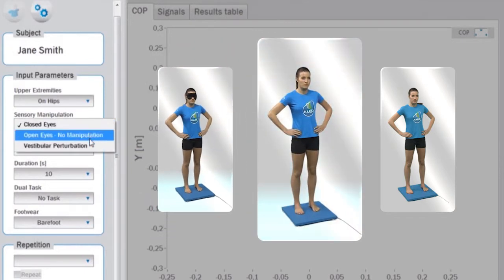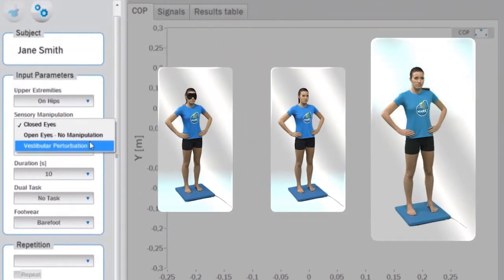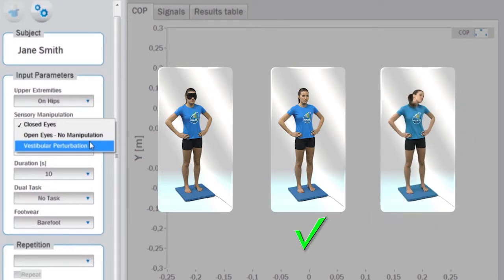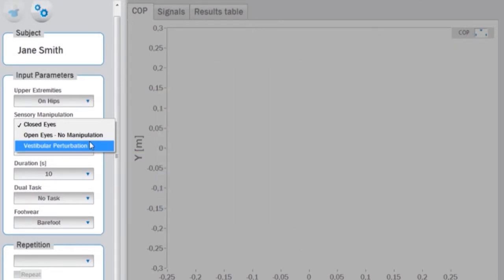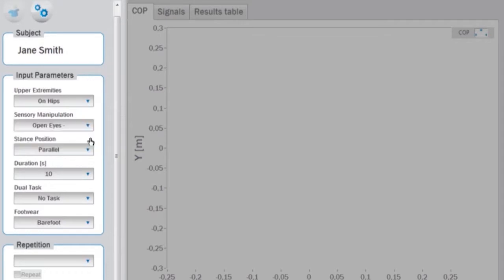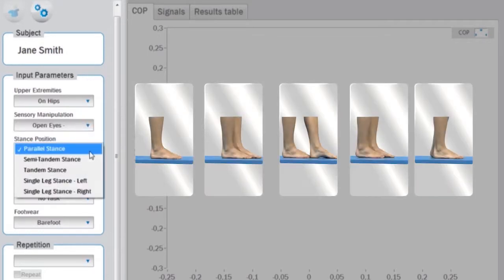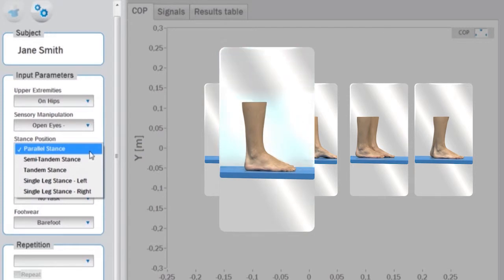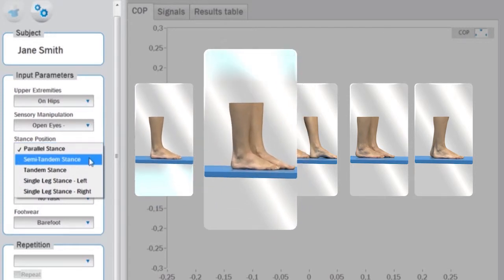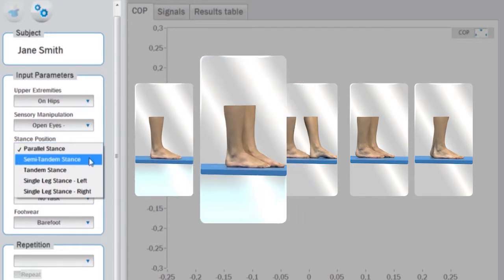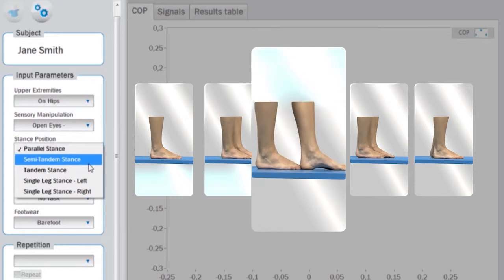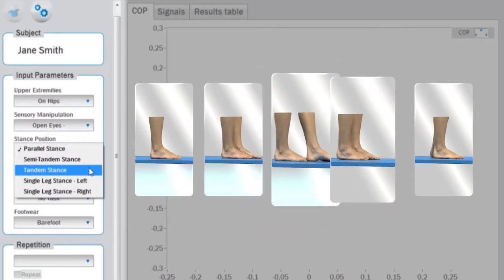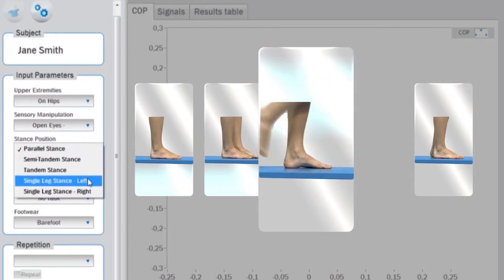After the sensory manipulation is determined, select the stance position where you can choose among parallel stance, semi-tandem stance, tandem stance, single leg stance on the left leg, or single leg stance on the right leg.